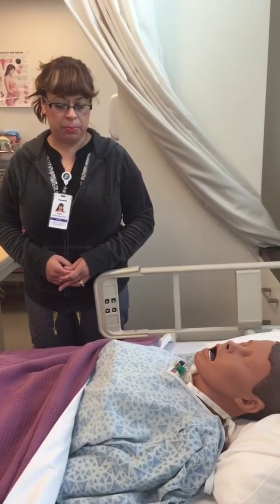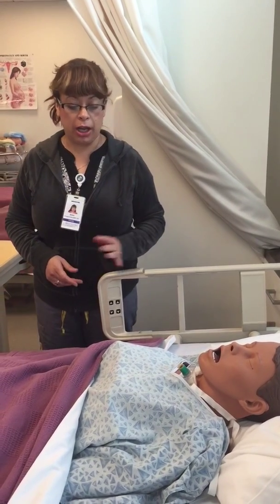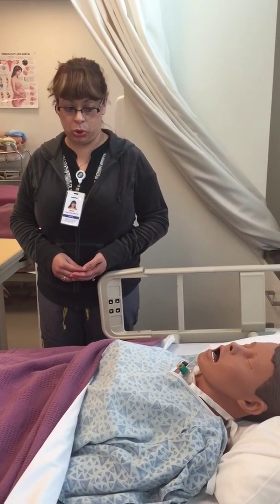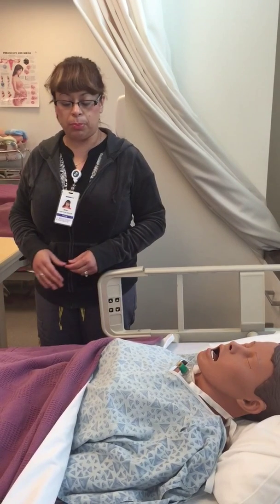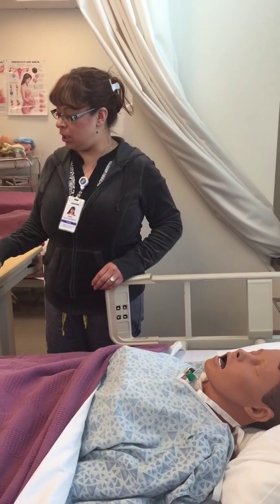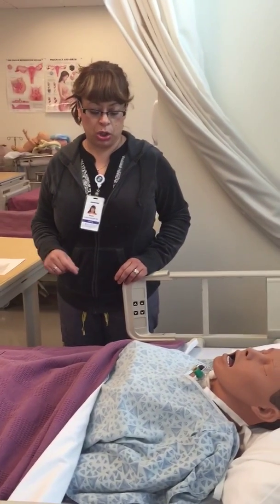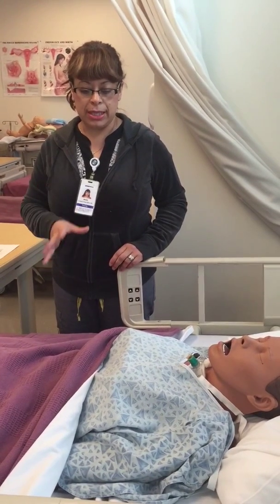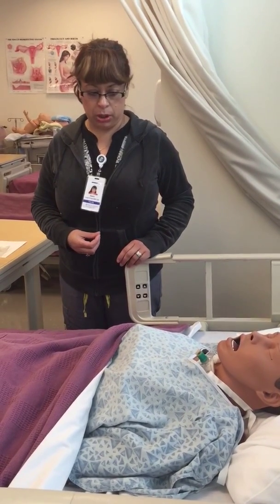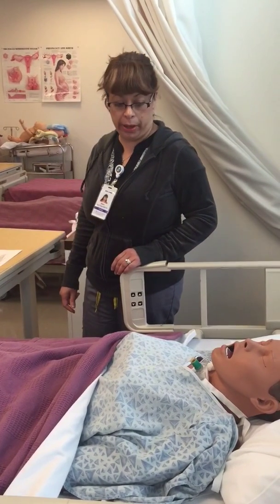So Mrs. Smith, because you're going to surgery, we're going to have to keep a good eye, and you're going to have anesthesia, so you won't be able to go while you're under. So we need to keep a good track of your urine, okay? That's why the doctor ordered it for you. So what it is, it's a catheter that's going to go into your private area, into your urethra, and it's going to stay in there with a balloon. It's going to keep it in place, and it's going to drain all your urine, so you don't have to worry about having to go, okay?